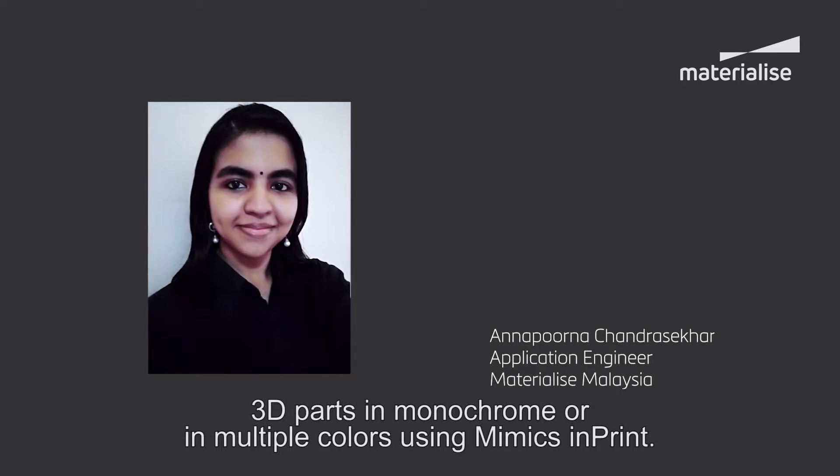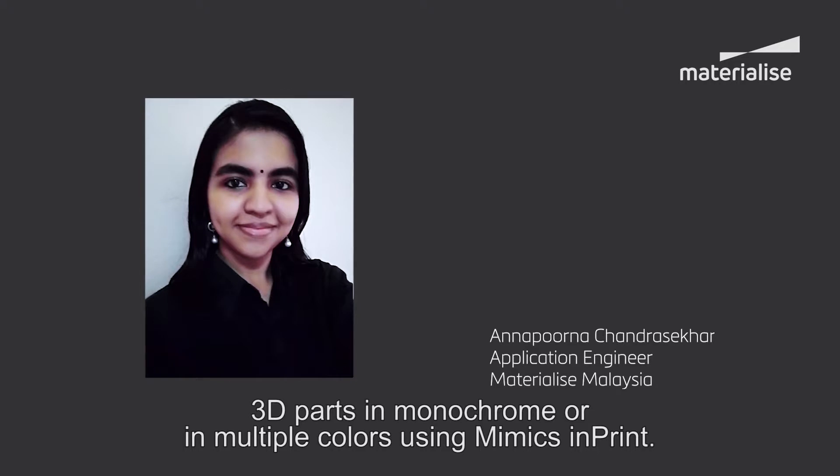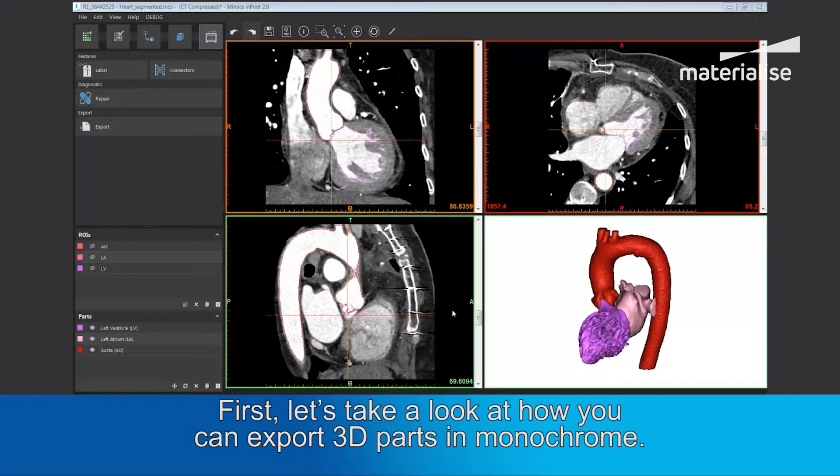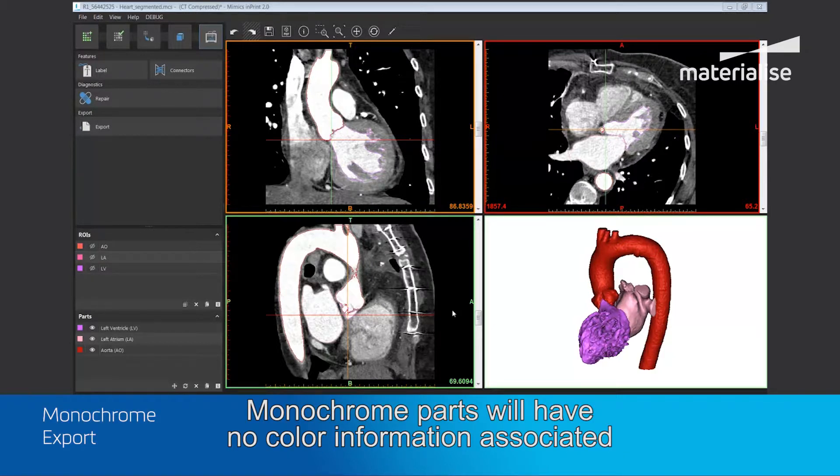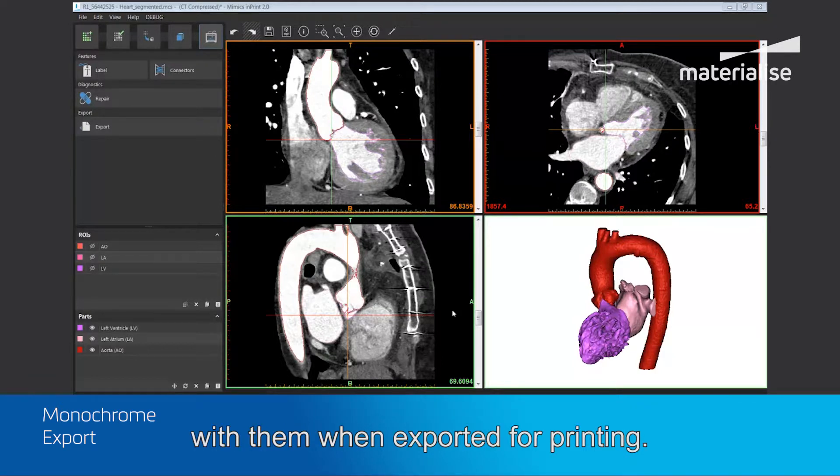Hi, I'm Anna and today I shall explain how you can export 3D parts in monochrome or in multiple colors using Mimics inPrint. First, let's take a look at how you can export 3D parts in monochrome. Monochrome parts will have no color information associated with them when exported for printing.